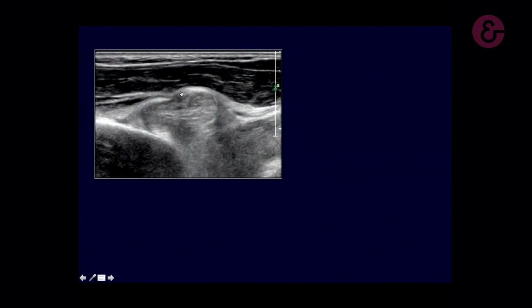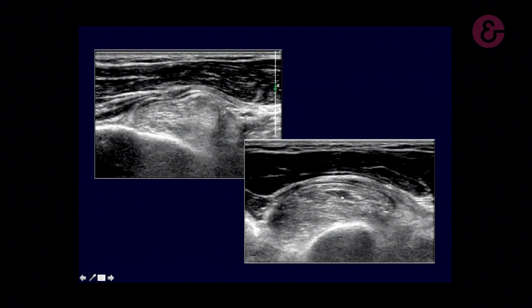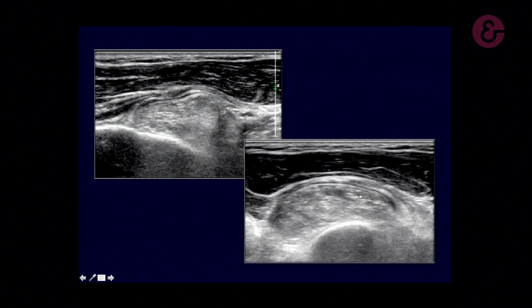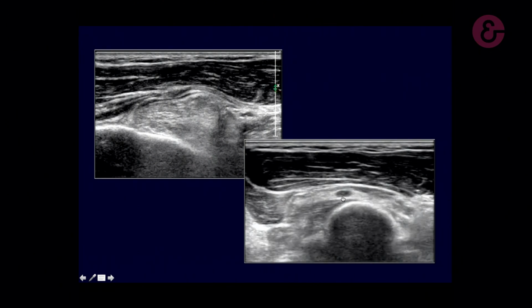And you can see the nerve here. Up, swelling nerve over there, compressed over there. And you can see that the lipoma also is compressed. What is the term in English? Clockwise, no? It's compressed, the lipoma. You can see it against the arcade, and this is the axial. Nice. Look at the nerve. It's very thin, and then there is huge enlargement of the nerve.